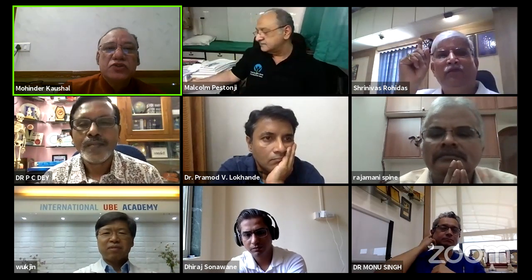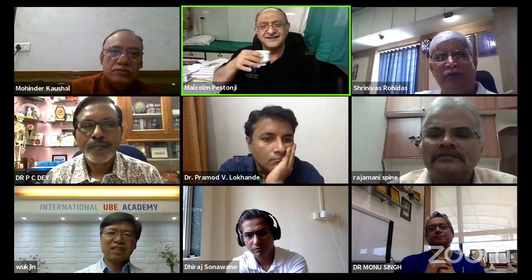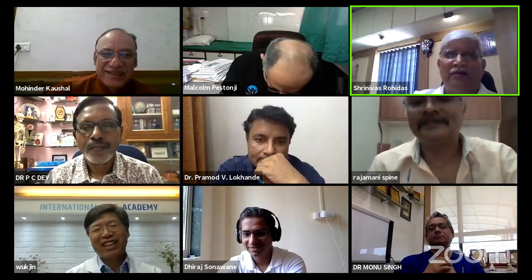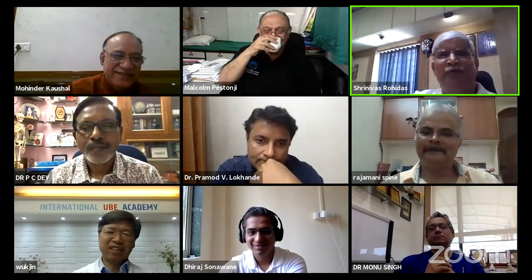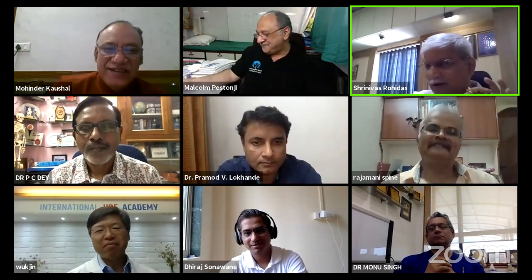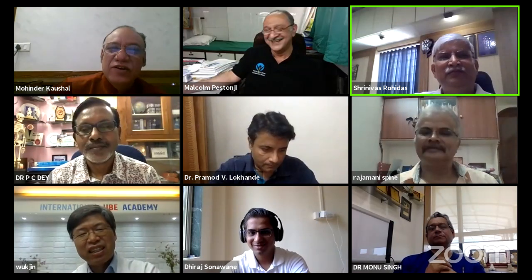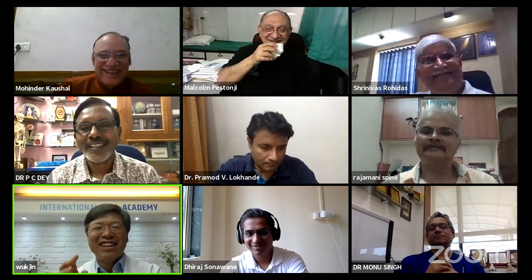Dr. Sohn, please. We are playing with the words. Interlaminar, yes, foraminal. Interlaminar is posterior. Foraminal is lateral. We are playing with fluid-based, air-based, pure endoscopic assisted. Sir, we are all endoscopic. There is no difference. Don't give youngster a message. He should choose what he is very good at. Dr. Sohn, okay, please. Finish my time.